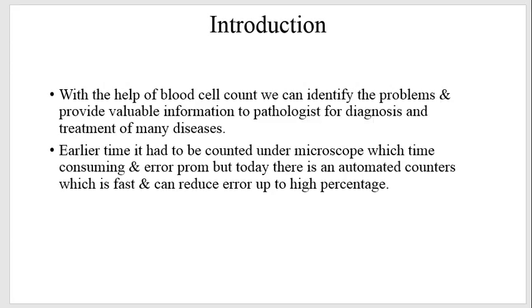He can just tell us what is the problem with the blood, and that will be fed into the software. This will obviously save cost and manpower, and most of the times if the person is new and doesn't have enough experience, he can make mistakes, but a software trained with the expert's knowledge will make fewer errors. And in medical conditions you don't prefer any error, so generally all the acceptable medical equipment will have accuracy above 99% only.